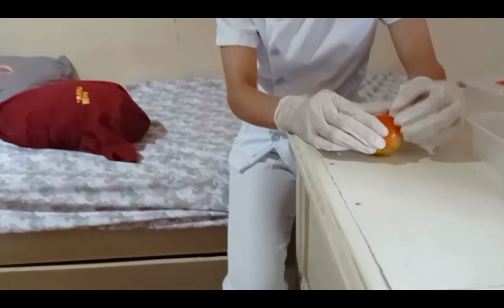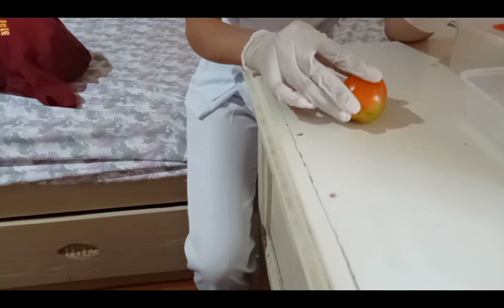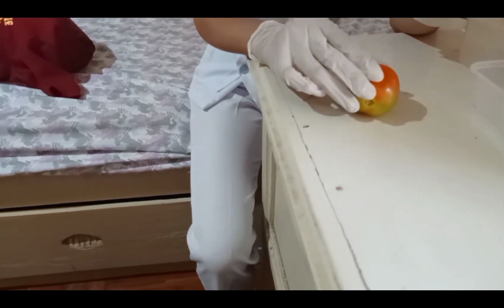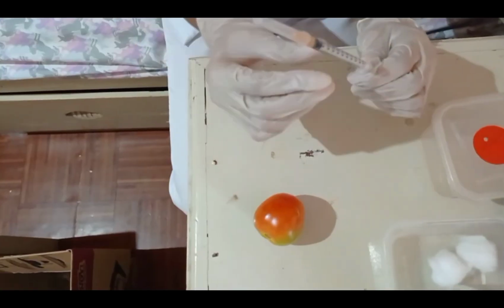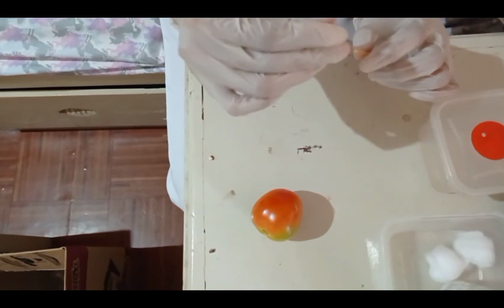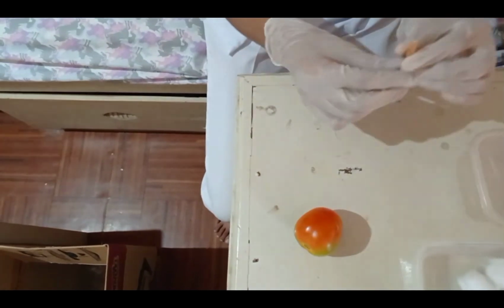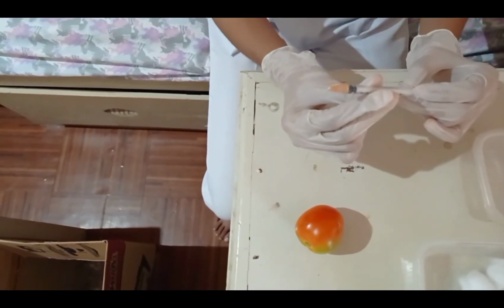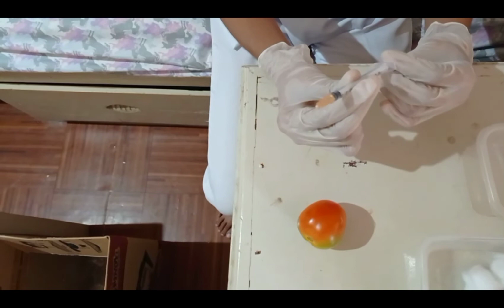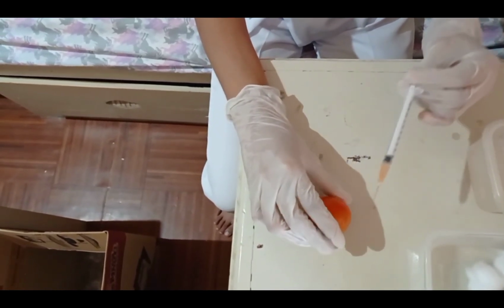Check the location. Select the appropriate site for administration. Assist the patient to the appropriate position. So, we remove the needle from the cap by pulling it off in a straight motion. Then grasp or pinch the area surrounding the injection site or spread the skin taut at the site.